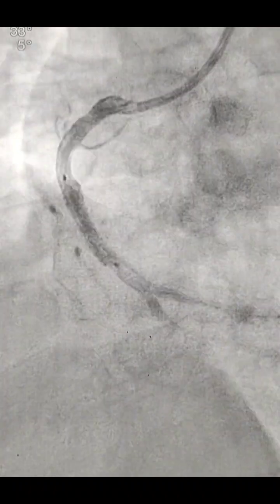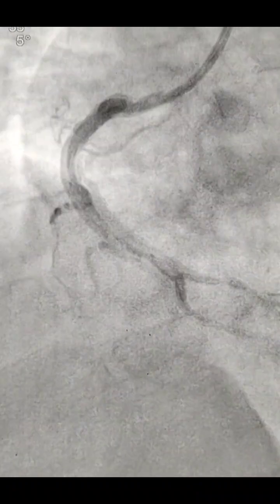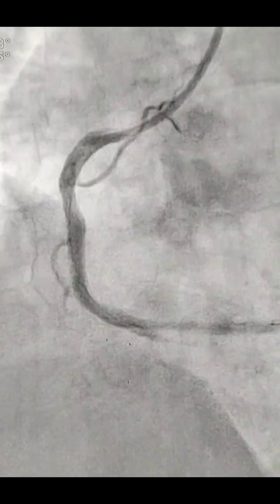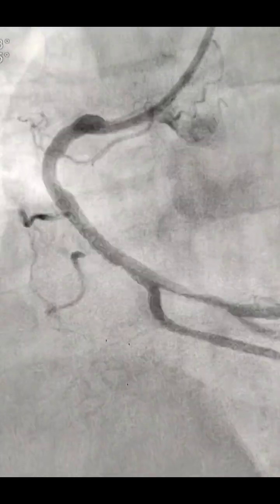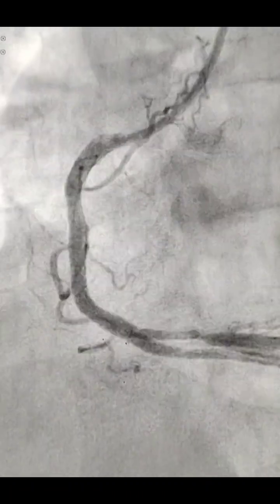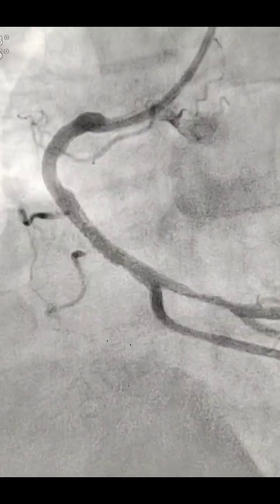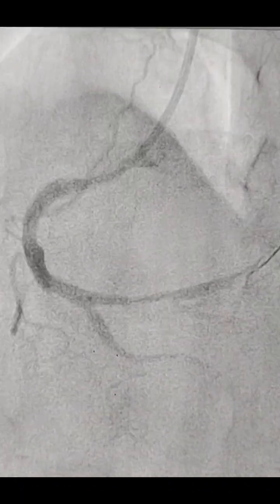So probably under deployment, or that aneurysm is there, or it may be a thrombus. So I inflated the same balloon once more, and still it is there. Still, somehow it looks good now. And I generally avoid the NC balloon in ACS cases because there are no-reflow possibilities. So I did not use an NC balloon in this patient for this stent.